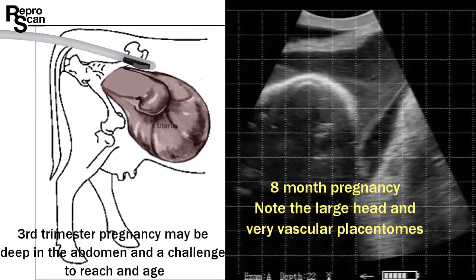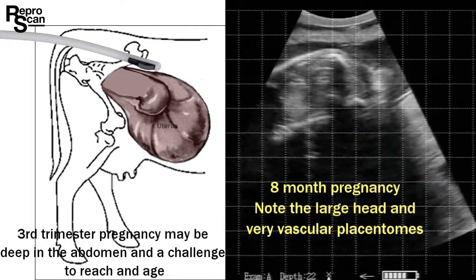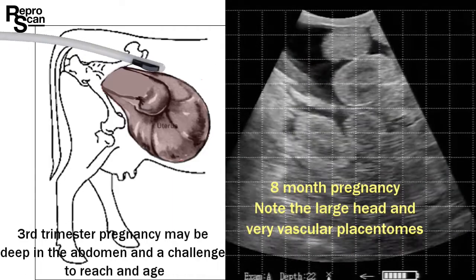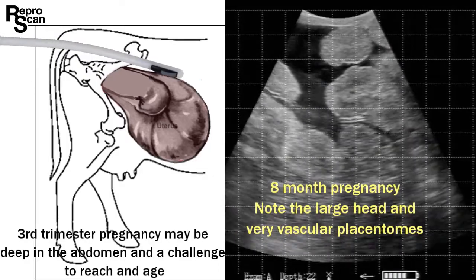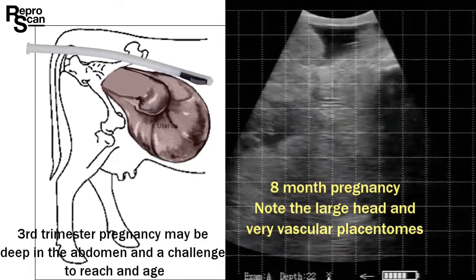We see large fetus, amnion with some debris in it, all the signs of a healthy, well-developed, near-term pregnancy. So that we can reconfirm that if we get some data that says 8 months, or otherwise I'd be more comfortable just saying 3rd trimester.